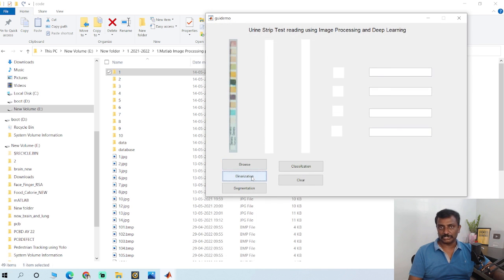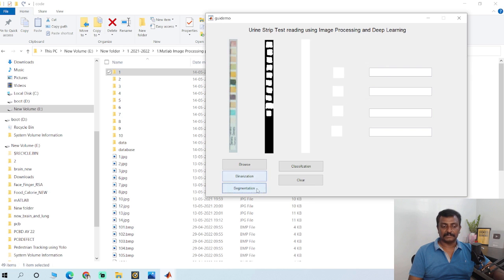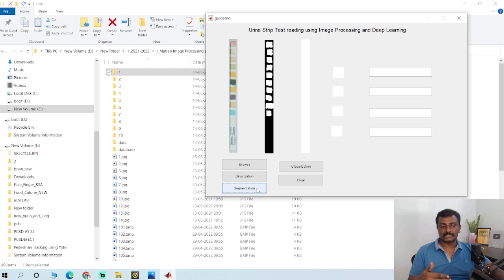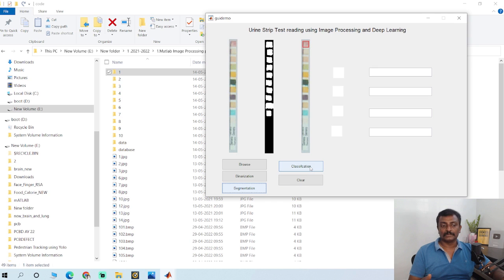Click binarization, and click segmentation to segment the blocks. Once segmentation is done, click classification to finally classify the output.